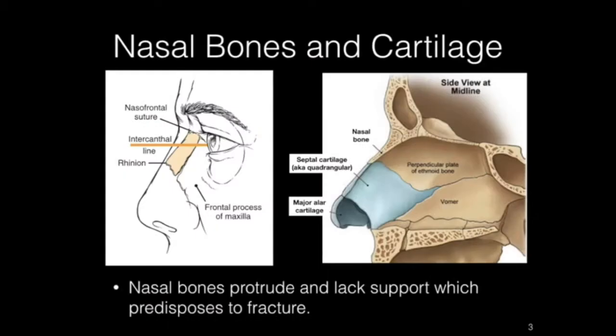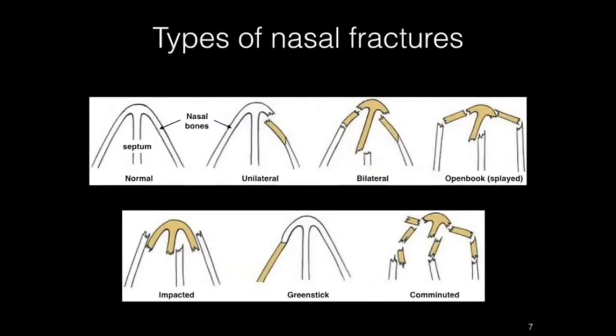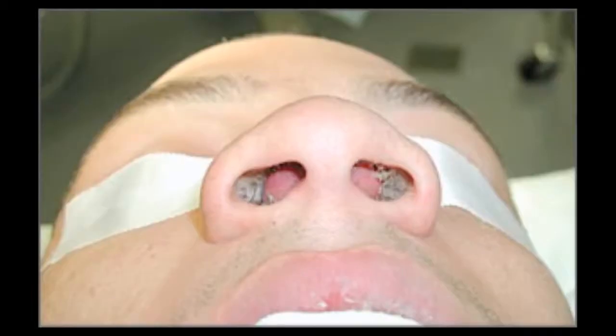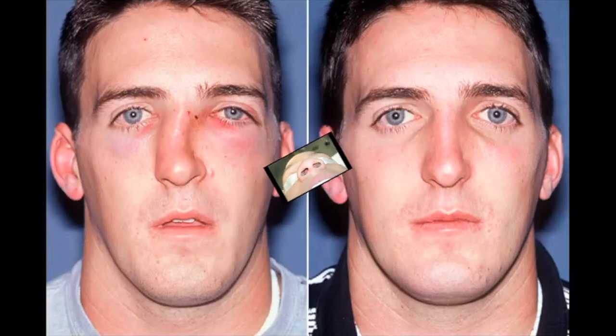When a nasal fracture occurs, it usually occurs at the inferior portion of the nasal bone, which is the thinnest, resulting in the deviation of the nose. It is important when there is a nasal fracture to check inside the nose for a septal hematoma. The light source is brought in, and when we bring the light source in examining the nasal septum, check the area anteriorly for any sites of bleeding. We also check for any nasal septal deviation, or if there was a nasal fracture, look for a septal hematoma.